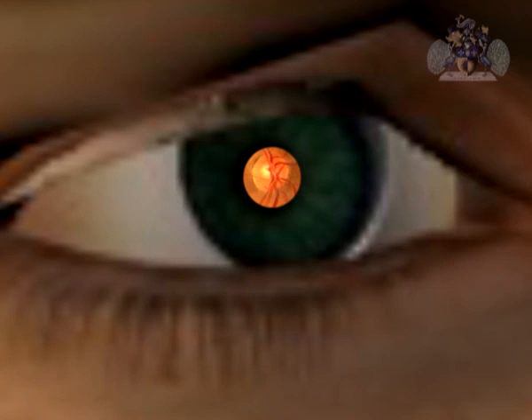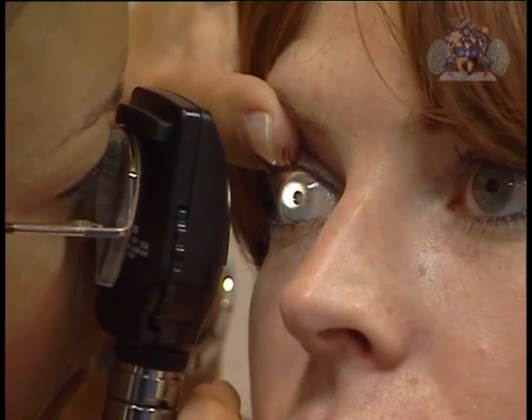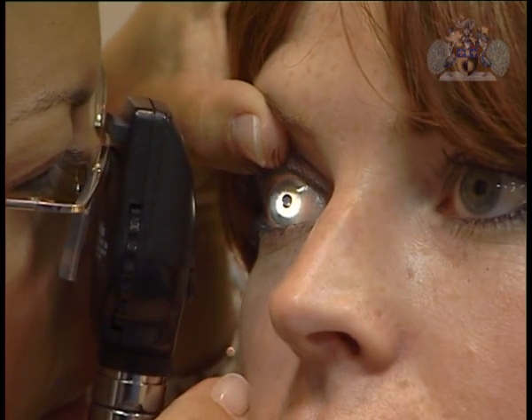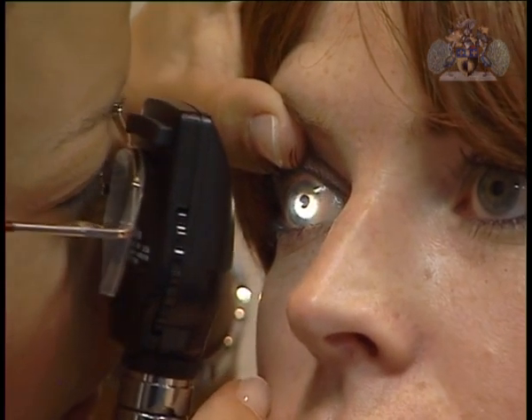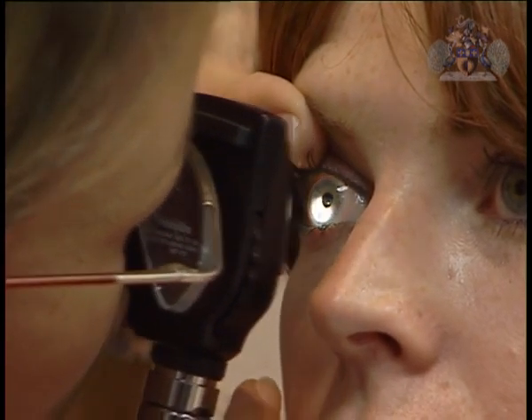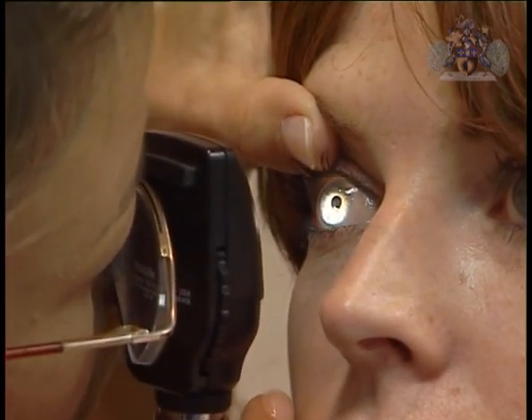In this correct position, the ophthalmoscope dial is then rotated until the image becomes focused. Stability is important because instability further adds to the difficulties of focusing the ophthalmoscope. The left thumb is usually resting on the patient's brow, but may be needed to lift the upper lid to allow viewing through more of the pupil. The right hand holding the ophthalmoscope is resting on the patient's cheek.